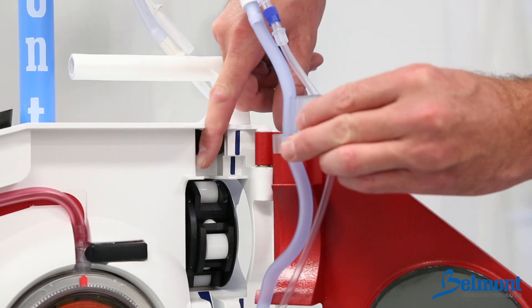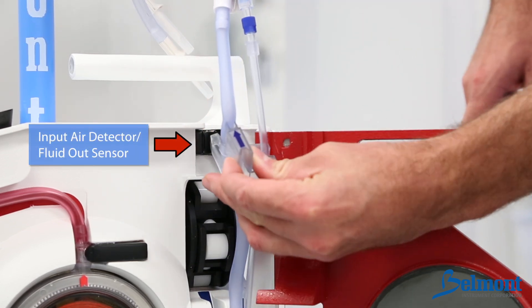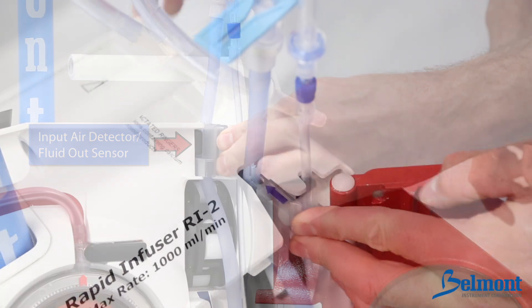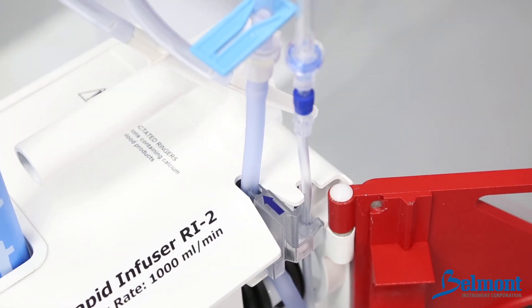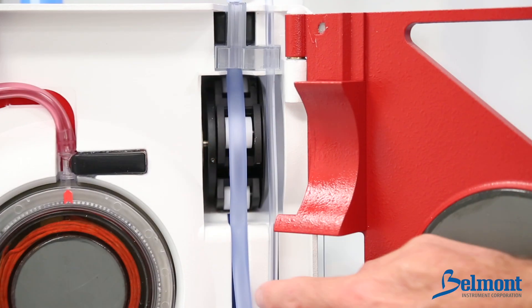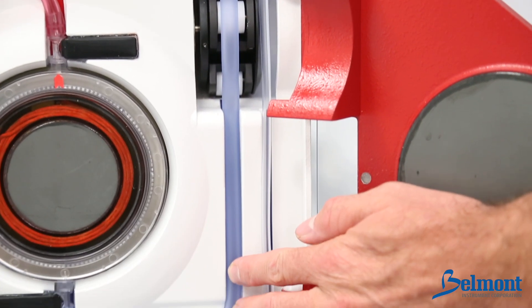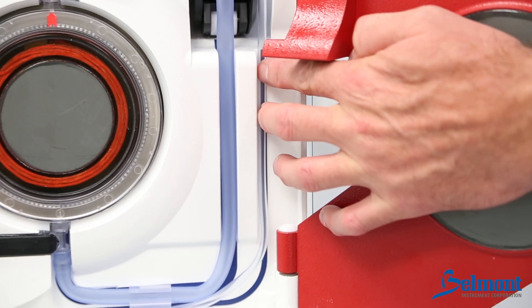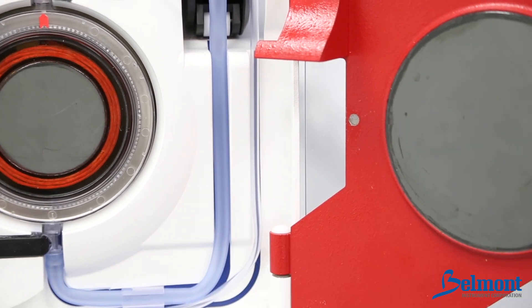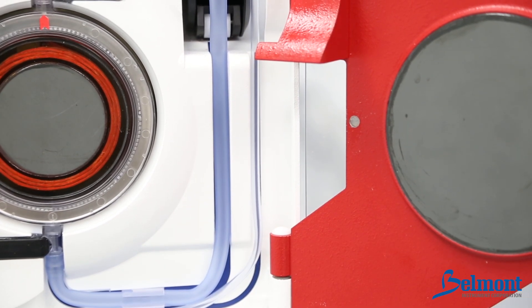Next, fit the interlock block on top of the shelf. The blue arrow should be upright pointing towards the ultrasonic air detector. The interlock block will be flush with the top of the machine. Thread the wider tubing over the center of the roller heads. Make sure that the larger tubing is in the groove of the wider blue line and the smaller tubing is in the groove of the thinner blue line. Avoid stretching, kinking, and cross threading the tubing.